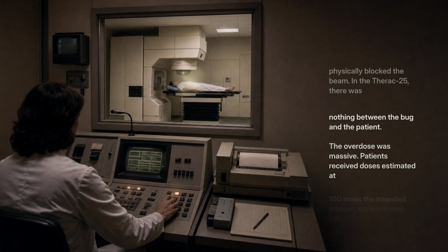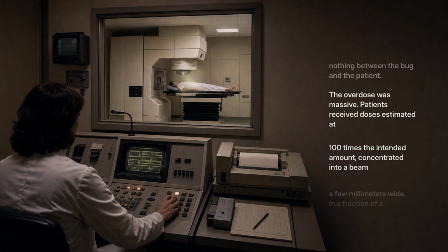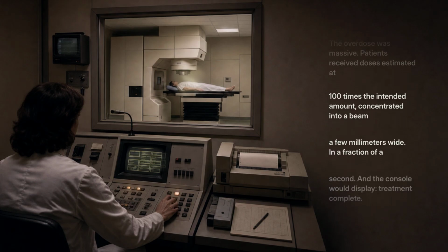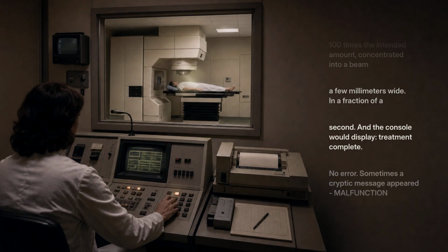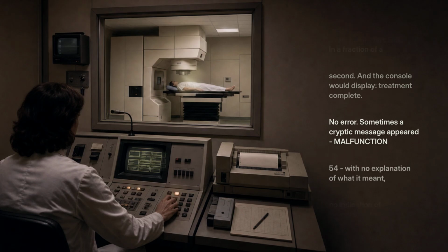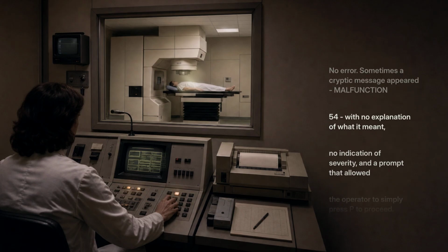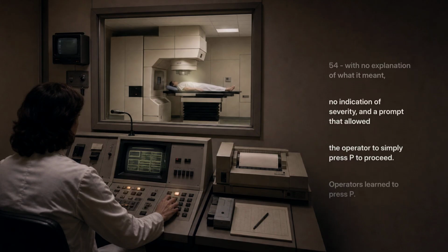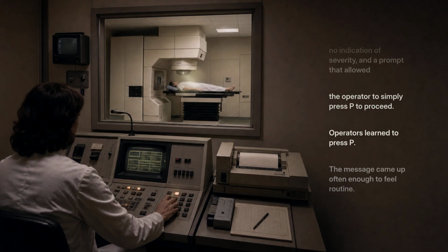The overdose was massive. Patients received doses estimated at 100 times the intended amount, concentrated into a beam a few millimeters wide in a fraction of a second, and the console would display treatment complete, no error. Sometimes a cryptic message appeared, malfunction 54, with no explanation of what it meant, no indication of severity, and a prompt that allowed the operator to simply press P to proceed.